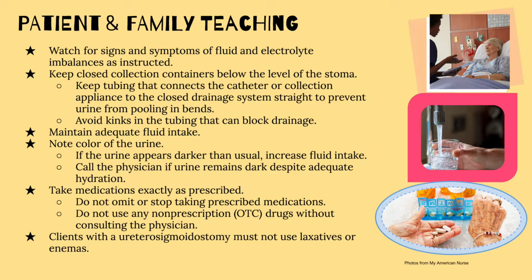Each aspect of care should be clearly explained by the nurse, including the role the patient will play in managing their own recovery. During teaching, patients should learn how to make observations, recognize signs of potential problems, and understand when they need to seek assistance.